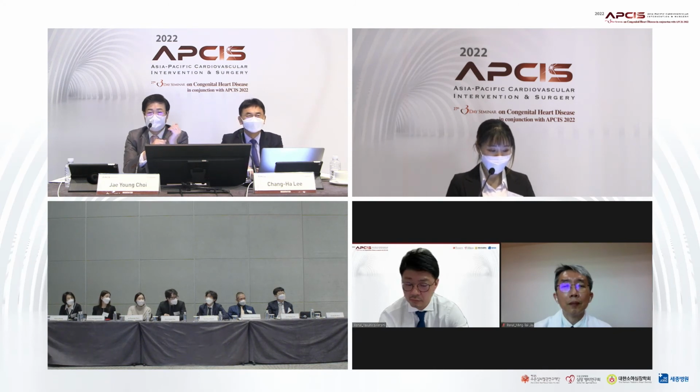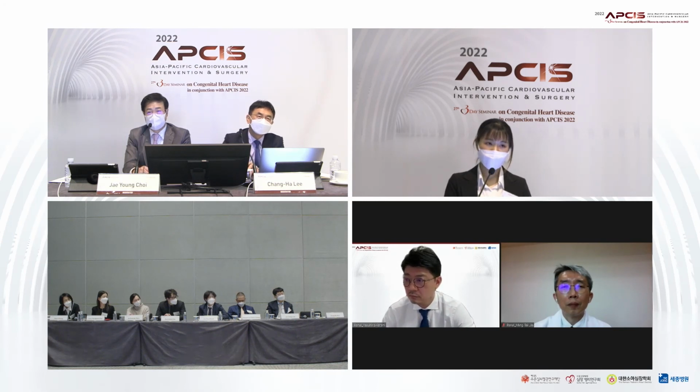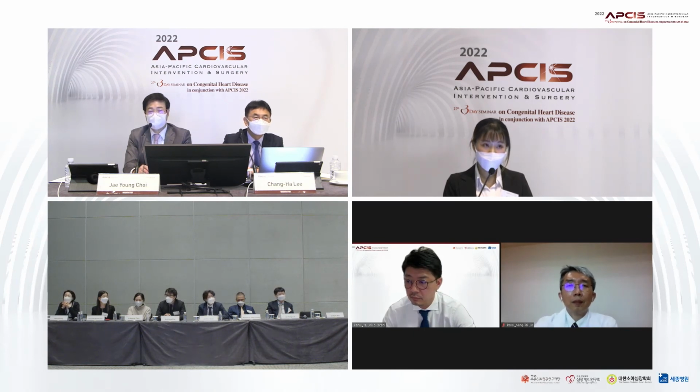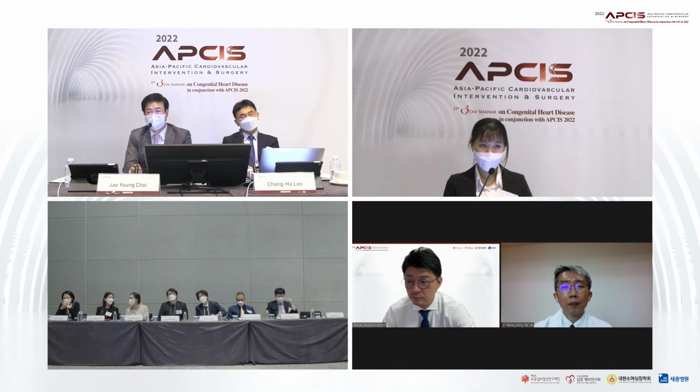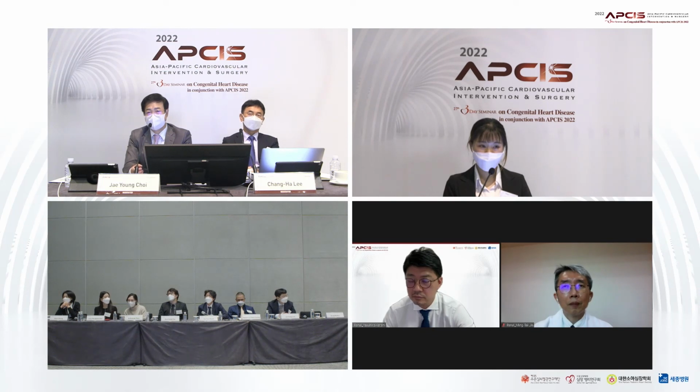Yeah, Dr. Warakan, please. Congratulations. I think this is a very fascinating case. Unfortunately, I did not attend from the beginning, but just to share with you, for obstructed TAPVR, especially the infracardiac type like this, in my country nowadays the surgeons are happier for us to do stenting because it buys time. In the textbook, obstructed TAPVR is an emergency surgical case, but now it's an urgent or emergency catheter intervention case. That relieves a lot of the obstruction, and after a few weeks or months the surgeon can go to the theater with less worry about pulmonary hypertensive crisis post-procedure.